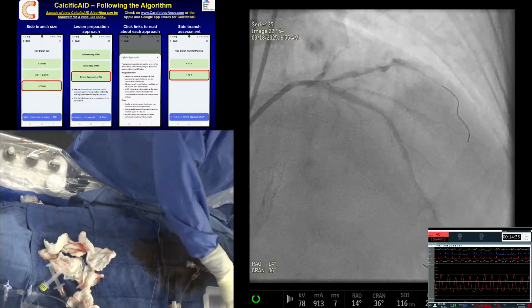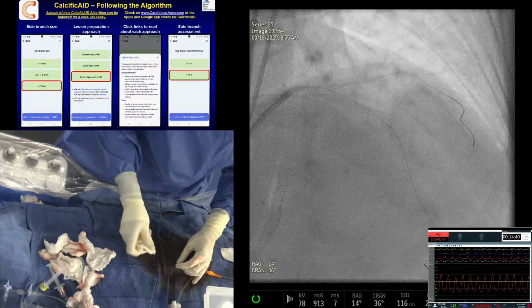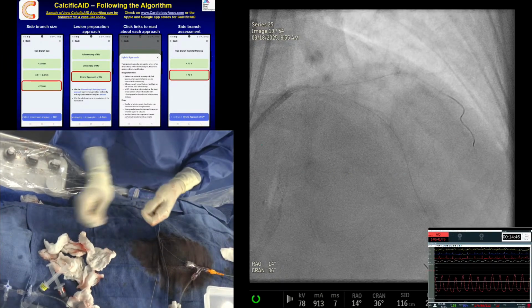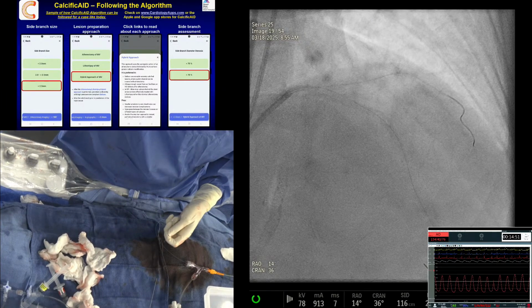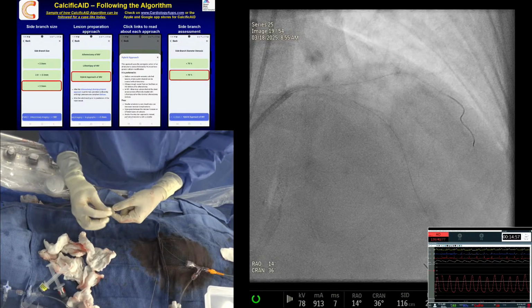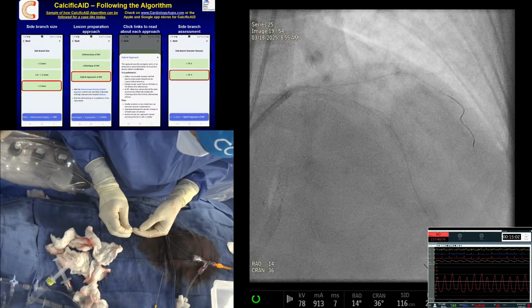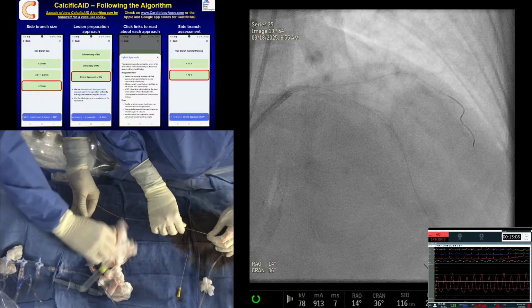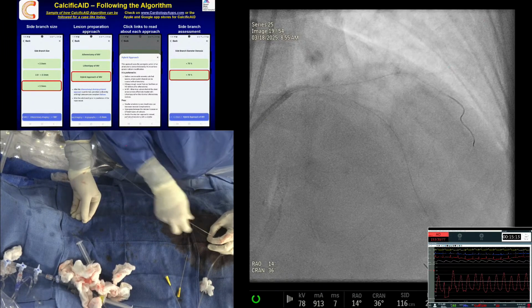You know, the flow in the LAD has not looked this good. I think with a little more diligence here, you'll have an outstanding result. My mind keeps going back to how the left main will be stented. So I'm going 3.0 by 33 to the LAD. We are going to IVUS the diag because I do not want to do bifurcation stenting since our calcific modification was not the best. I'm worried about stent under expansion.